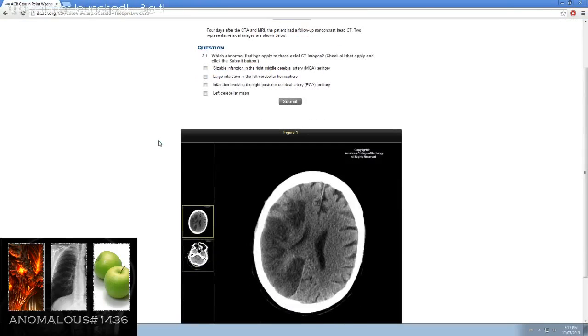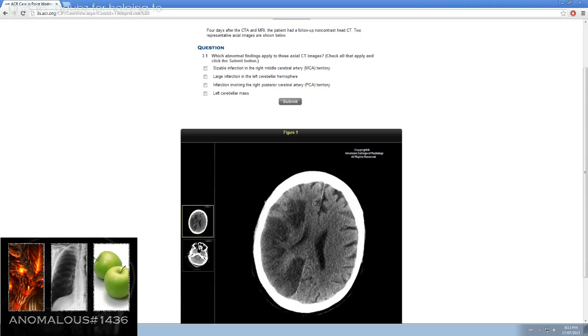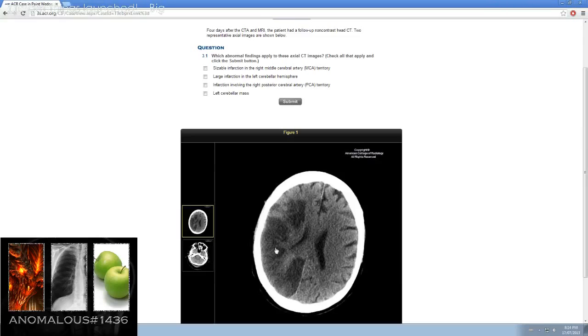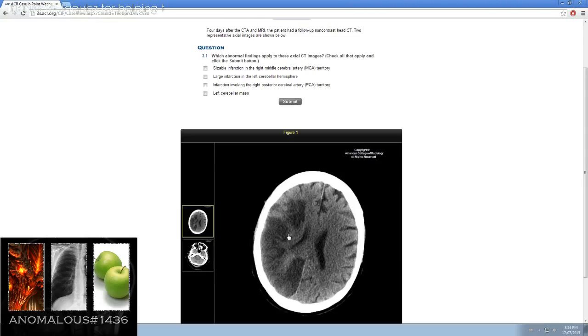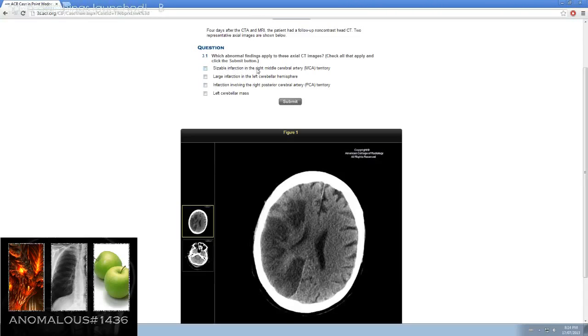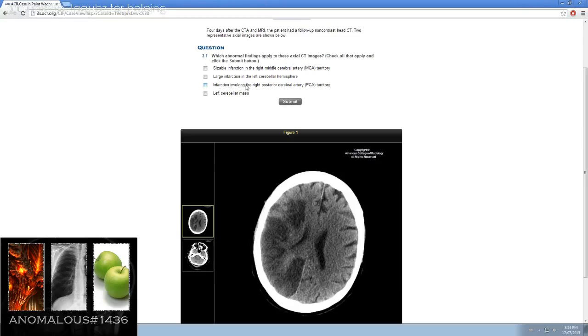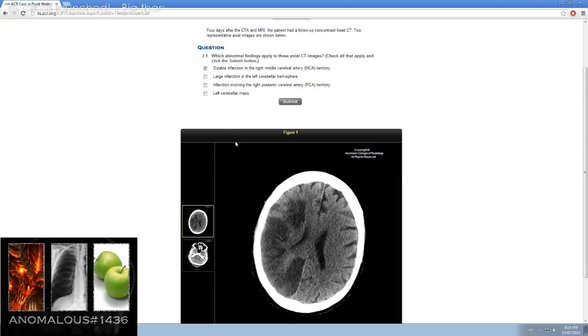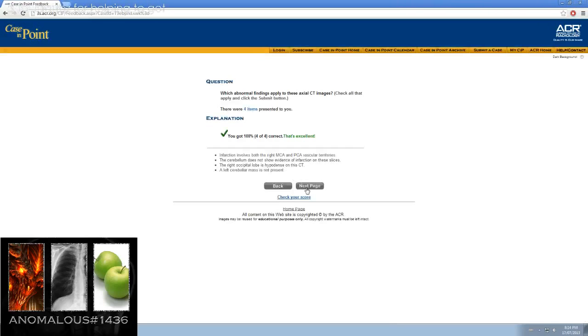Four days later after CTA and MRI, the patient had a follow-up non-contrast head CT. Two representative axial images are shown below. Here looks like this kind of ill-defined hypodensity not going completely to the cortical gray matter, mainly affecting the white matter with some effacement of the ventricles, no midline shift. So it looks like a sizable infarction, the right MCA territory, large infarction left cerebellar hemisphere, infarction involving the right posterior cerebral artery PCA territory. That is definitely true and that is possible.